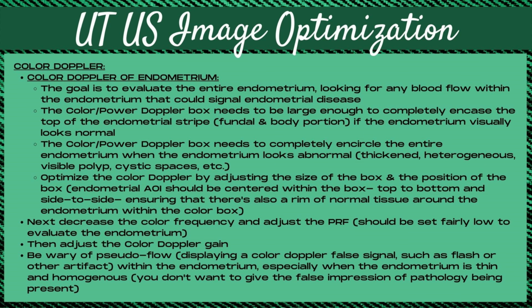And next you want to decrease the color frequency and adjust the PRF lower. This should be set fairly low to evaluate the endometrium. Next, adjust your color Doppler gain. And be wary of pseudoflow. Don't want to display a color Doppler false signal, such as flash or other artifact within the endometrium, especially when the endometrium is thin and homogeneous. This would give a false impression of pathology being present when it's not.